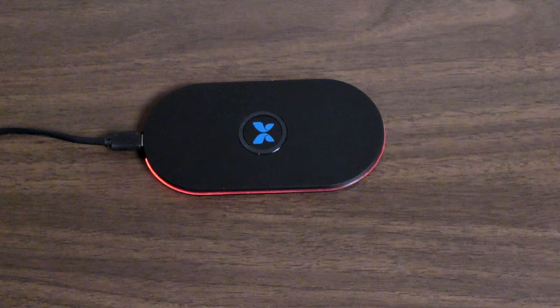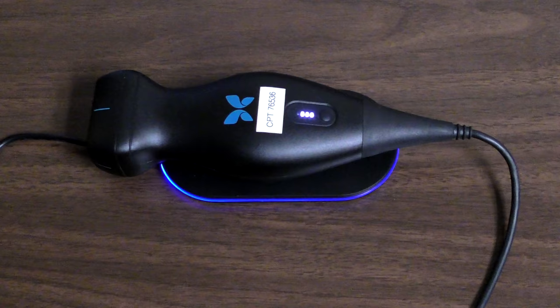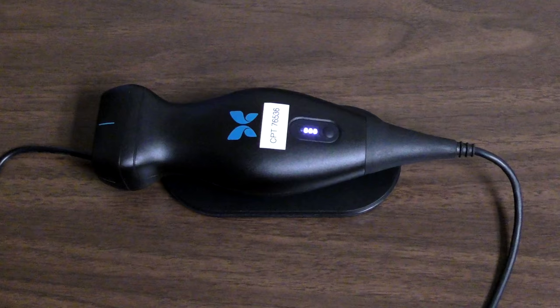The Butterfly IQ is powered by an internal rechargeable battery. The battery can be recharged wirelessly with the supplied charging pad. With a full charge, more than 2 continuous hours of scanning can be achieved.